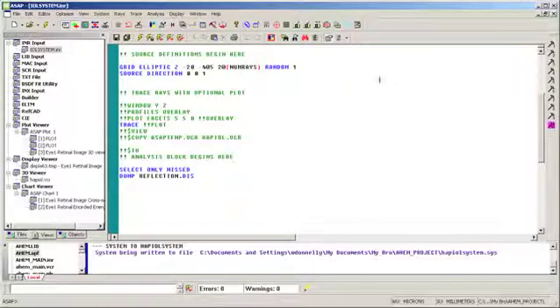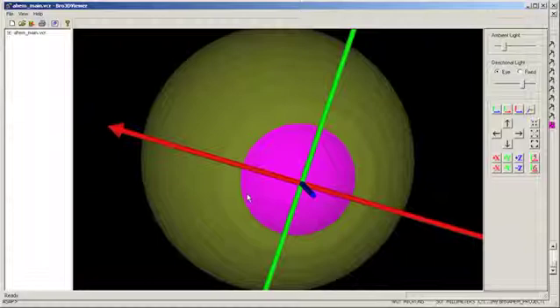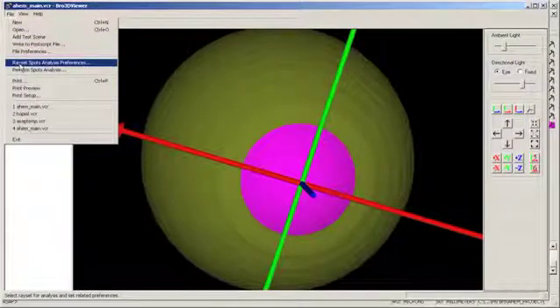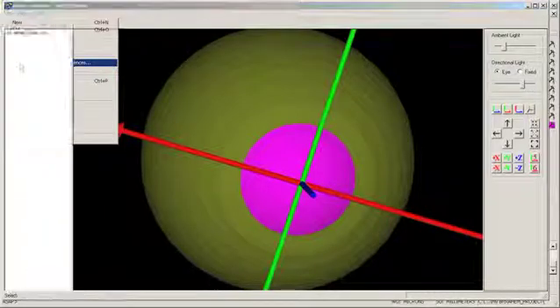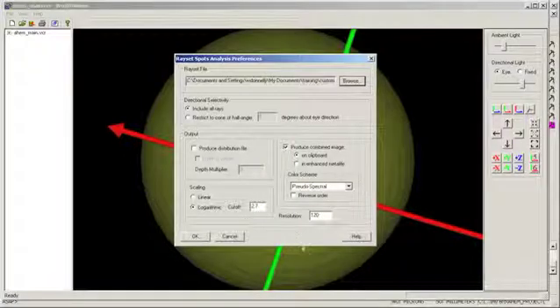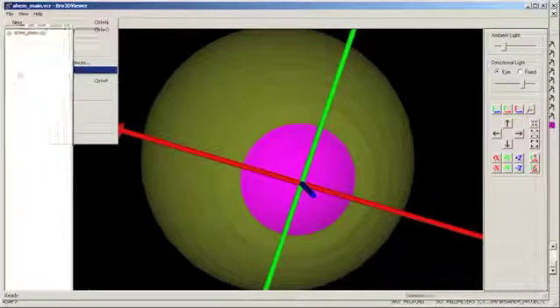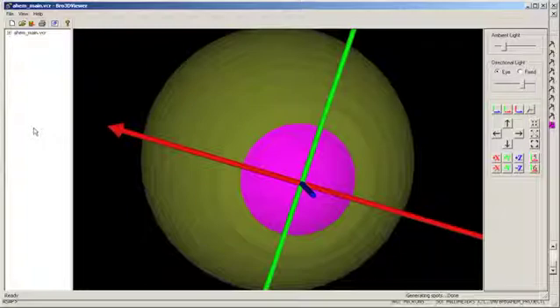So then I go into the Breault 3D viewer, and I have my geometry of the eye, which I'm going to zoom into a little bit. And I go here and I say I want to set up my spots analysis preferences. And I pick that file that I just generated up here. And I'm going to include all my rays, and there's some various other settings for the Breault 3D viewer for lit appearance modeling. And I say OK, and then I perform a spots analysis.